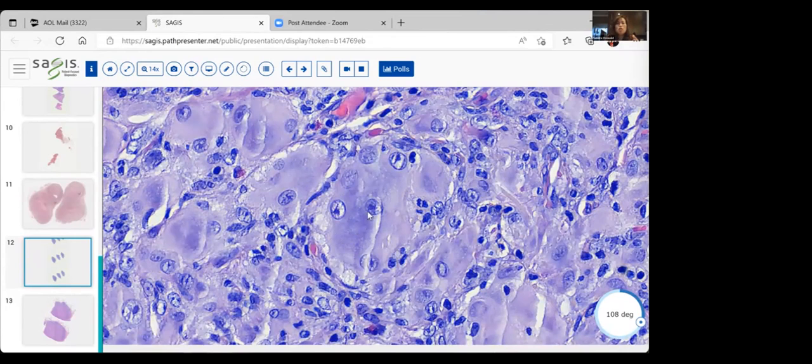But if you have someone who has multiple of these nodules showing you multiple reticulohistiocytosis, they could have more problems, right? So in that case, these cells aren't necessarily representative of a good thing. It's a bad thing, right? And in this case, the individual could be at risk for a mutilating arthritis, right? That's our board match. Multicentric reticulohistiocytosis associated with mutilating arthritis. But they also can be at risk for underlying tumor or cancer in maybe 10% of people.